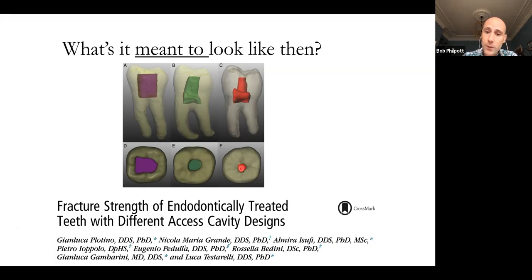It's really difficult to take an intraoperative radiograph with your cones. So you do what everybody does in that situation and you try to do it. And then you say, look, actually, I don't think I need it. It's too difficult. Or you take it with fewer cones in there than you have canals, or alternatively, you take multiple radiographs, and all of that just doesn't make sense to me.